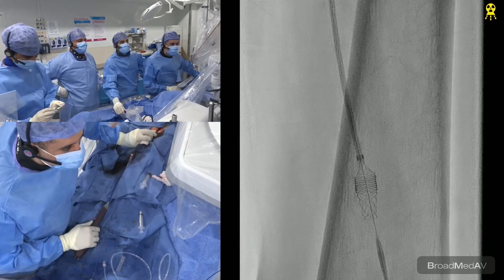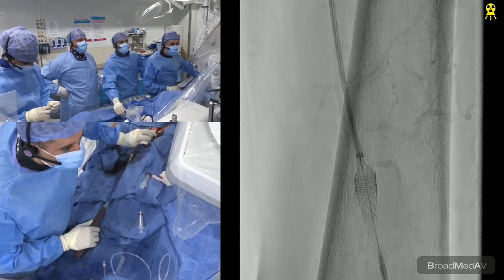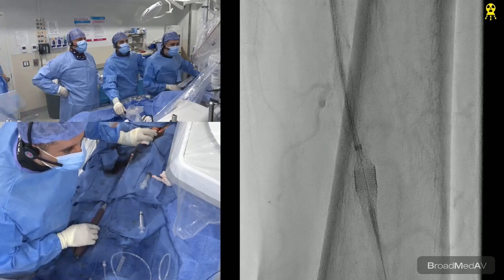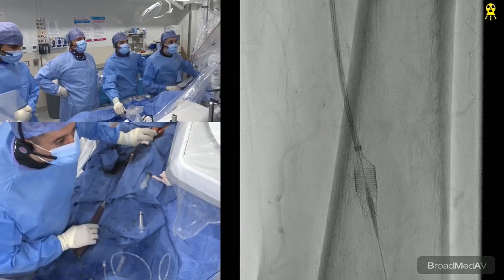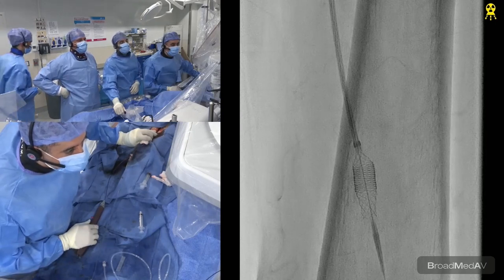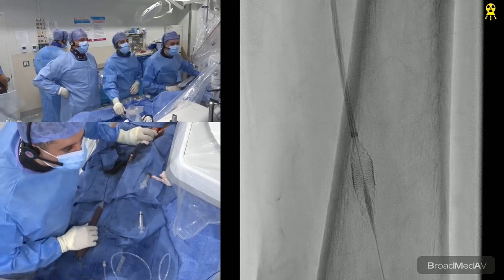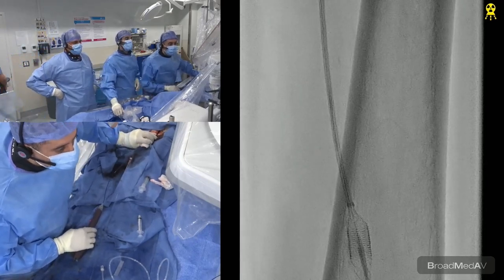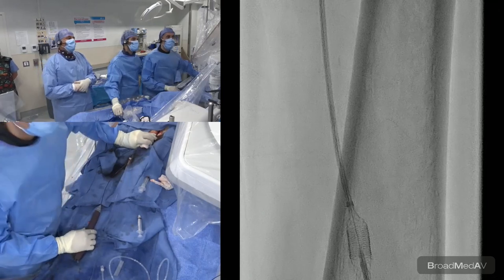And again, as he's deploying it, Raman will give it a little dye proximally for us to see it. You can see this is really stacked real hard. Where's the proximal? No, a little further higher up. Quite a bit higher. So you're going to maybe not have to stack it that much. I don't want to stack it. Show me a little higher, Raman, since it's coming out like butter.